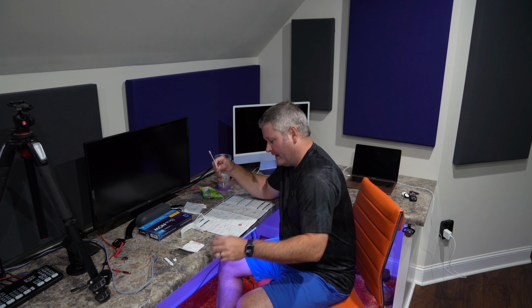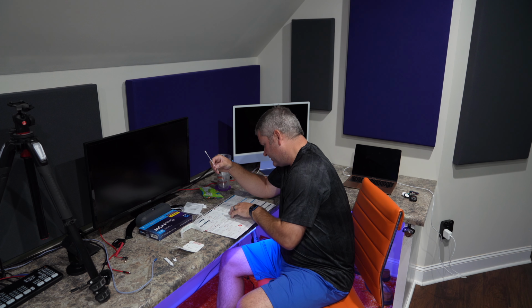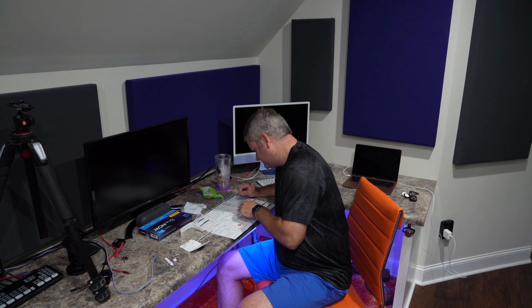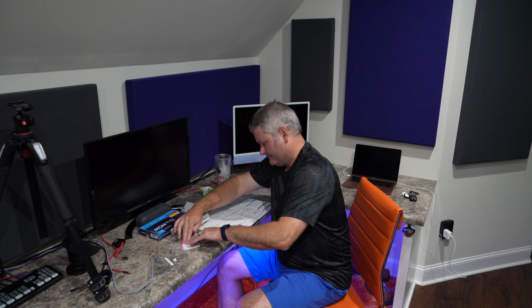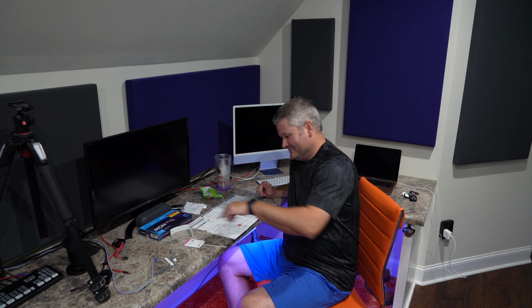Insert the tip of the swab into the bottom hole. Firmly push the swab tip from the bottom hole until it's visible in the top hole. And then twist 3 times to mix the swab with the drops. Uno, dos, tres. That's 3 times. And now, leave the swab in the card for the remainder of the test. Peel the adhesive off, which is this side right here. I'm going to peel off the adhesive. Close the card. Keep the card face side up, which is this side. Looks like a popsicle, a little lollipop.